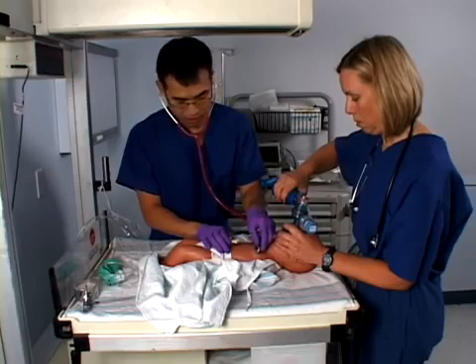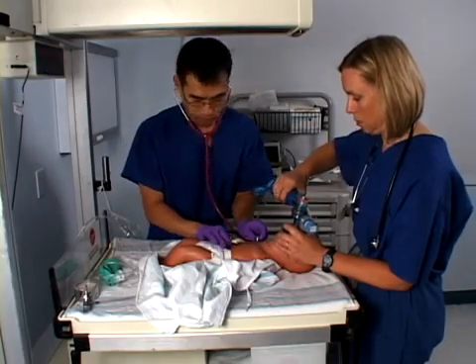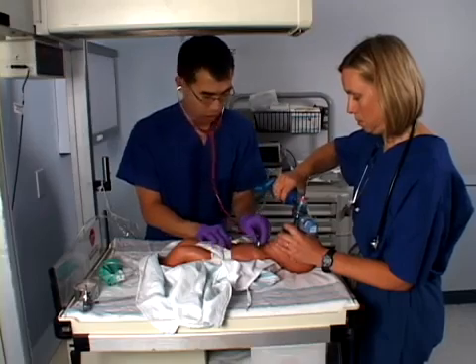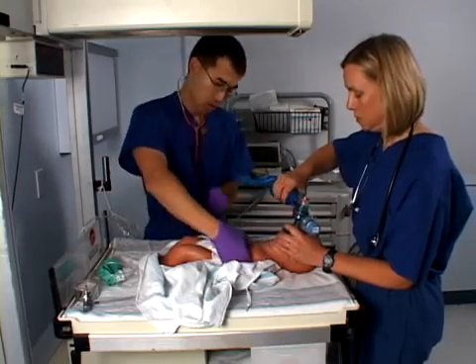I hear good breath sounds bilaterally. There's good chest movement. The heart rate is about 30. I'll start chest compressions. Okay.